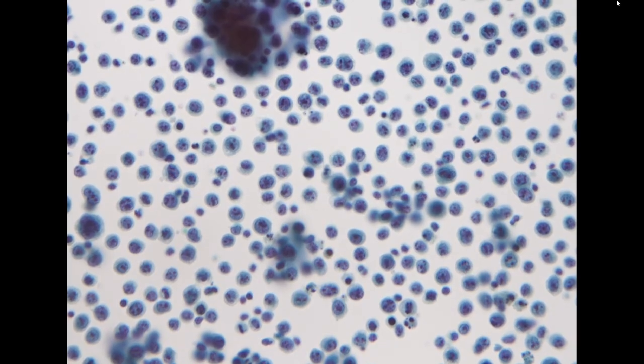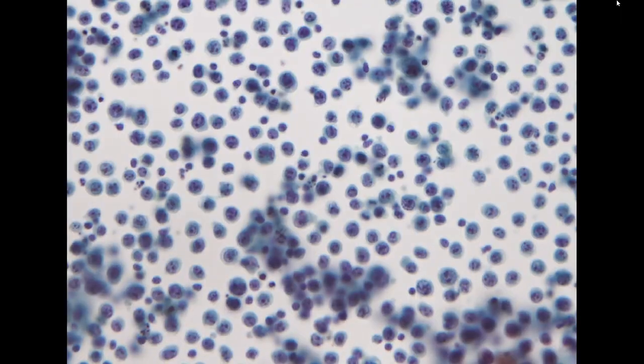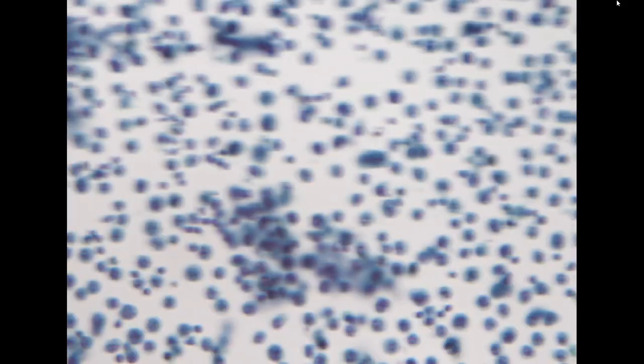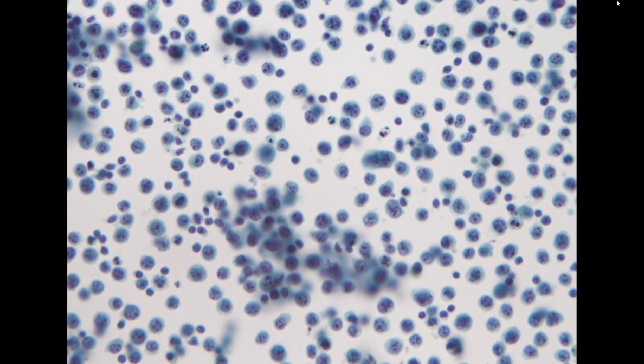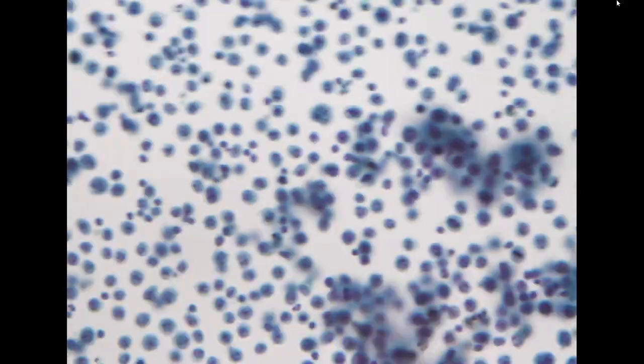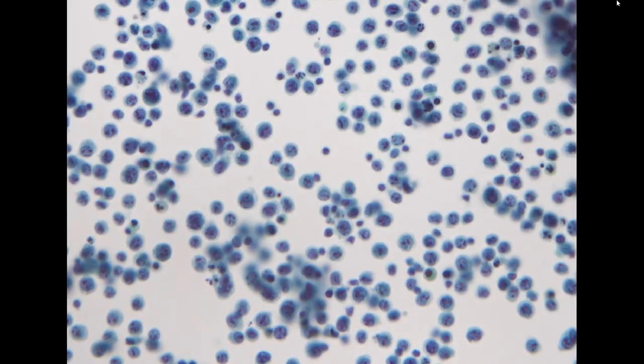And this is a specimen from a different site. It's from ascites, but it is also a body fluid specimen. So here you can see this is hypercellular, and all these single cells have increased NC ratio with 1 to 2 smaller nucleoli, and this is typical for lymphoma. So this is the involvement of both the pleural cavity and the abdominal cavity.